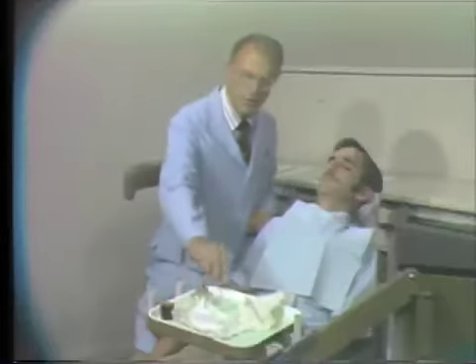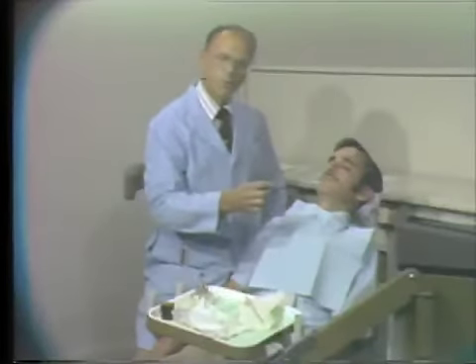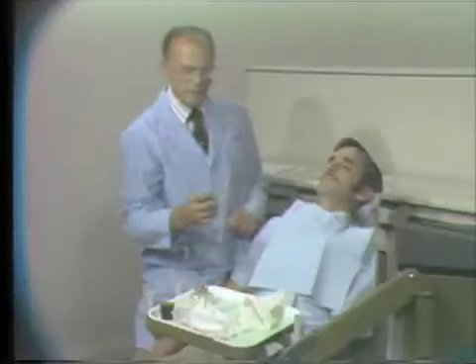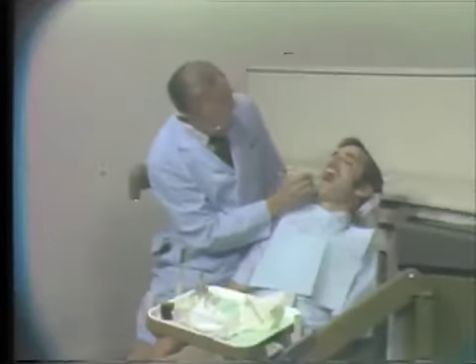First, we will show the collection of a specimen for gram staining and immediate identification in the laboratory. For this purpose, we will use the wire loop, or in this case, a small platinum spatula, which has been previously sterilized by flaming it. We will collect our specimen from the soft palate region by light scraping of the area where we expect to see or find some growth of the pathogenic organism.